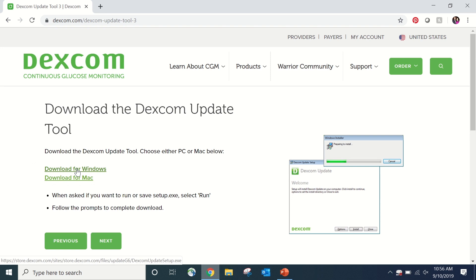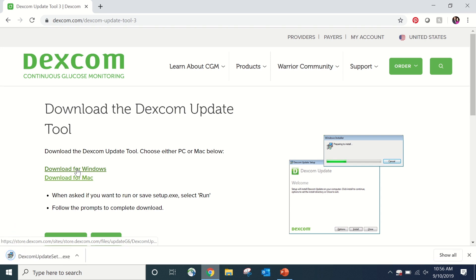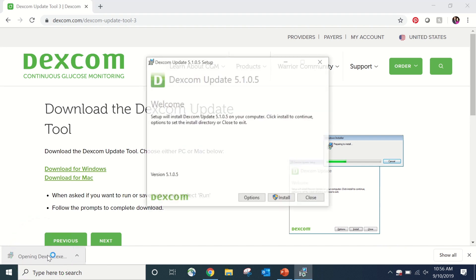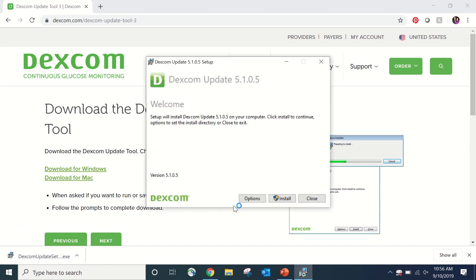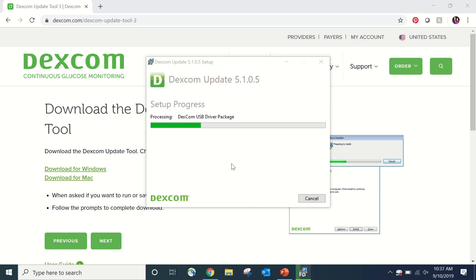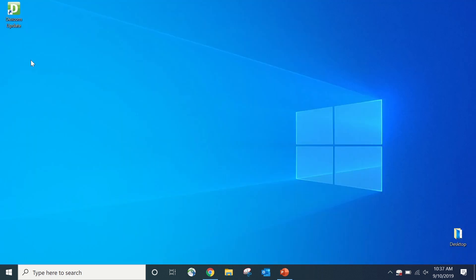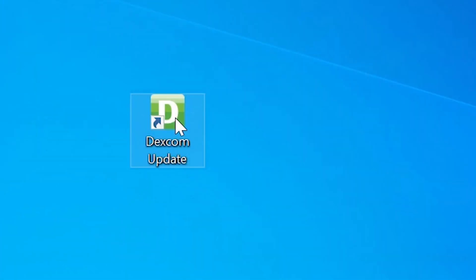If asked if you want to run or save setup, select Run. After a few moments, you'll notice that the Dexcom update tool is ready to be opened on your taskbar. Double click on that notification in order to bring up the installation window. Follow the prompt to install and wait for it to complete. This stage may take some time. The tool will be displayed on your desktop, which means we're ready to move on to step two and update your touchscreen receiver.